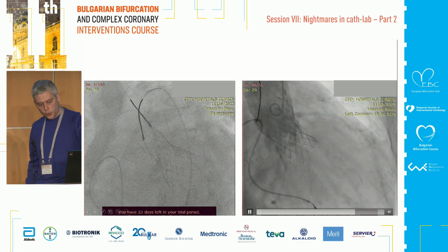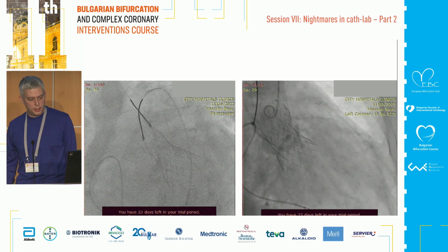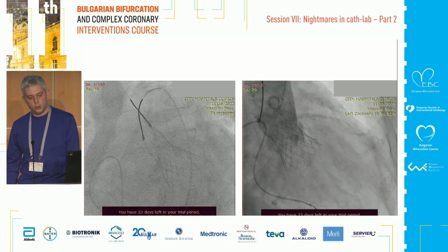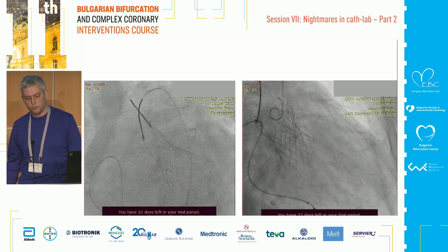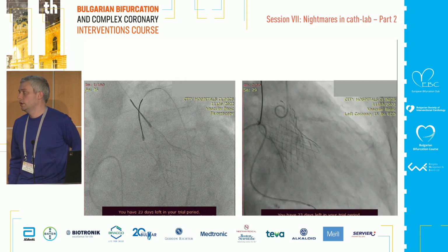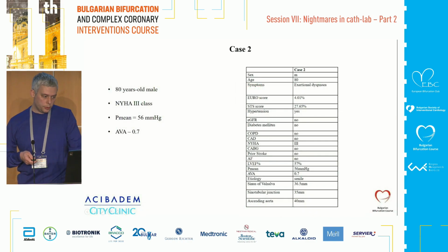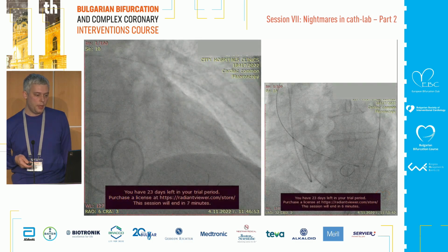So in this situation, the nitinol frame seems to be quite well expanded, and also the aortic regurgitation is acceptable. So we didn't do the post-dilation, because otherwise we risk embolization into the other direction. I'll try to be fast. Our second case is an 80-year-old male.